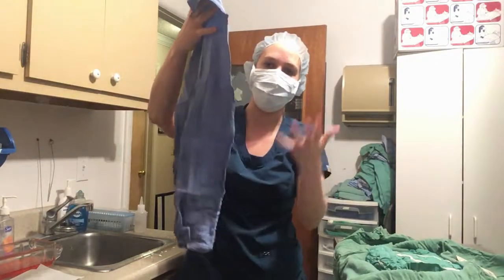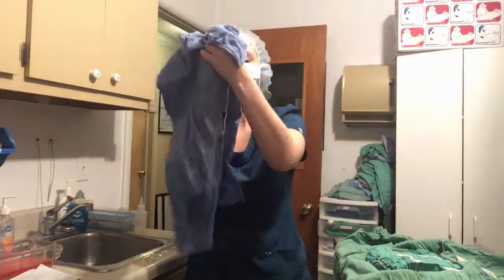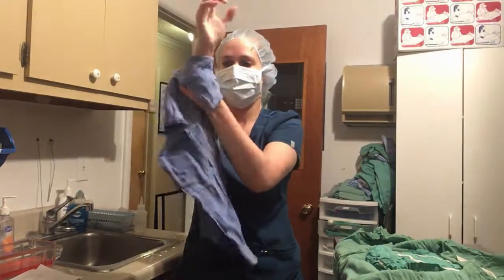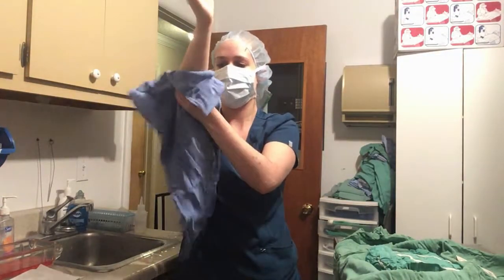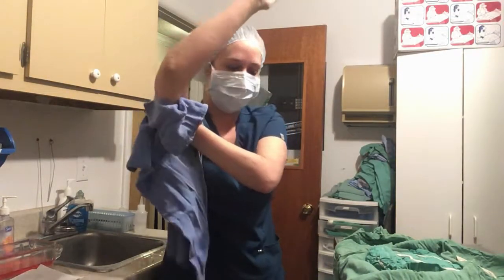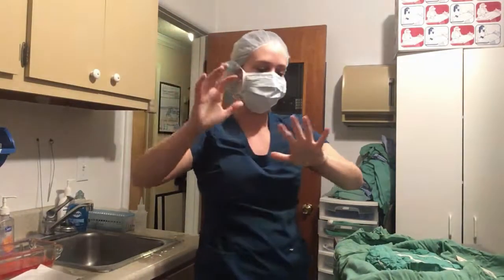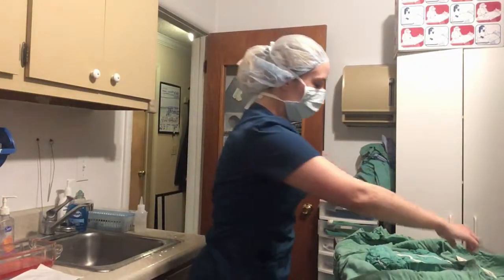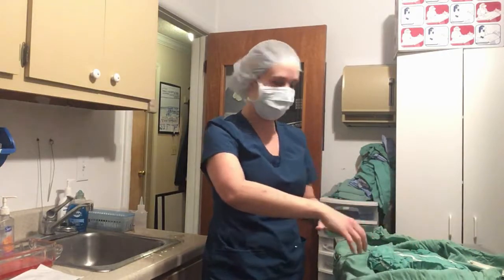And so I'm going to go ahead and take the other side and do the exact same thing. And again, you can just drop it since you don't want to touch anything that is non-sterile. So the next part is going to be getting gloved up, or putting on your gown.